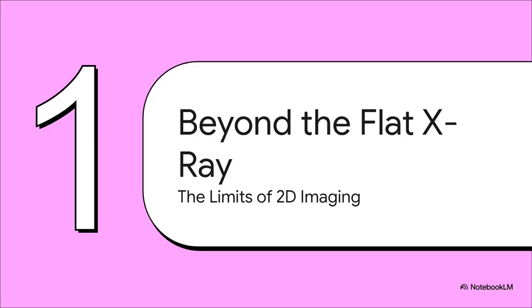So to really get why this 3D stuff is such a big deal, we gotta look at what came before it. Let's talk about the old school X-ray that pretty much all of us have had and figure out why it was time for a change.